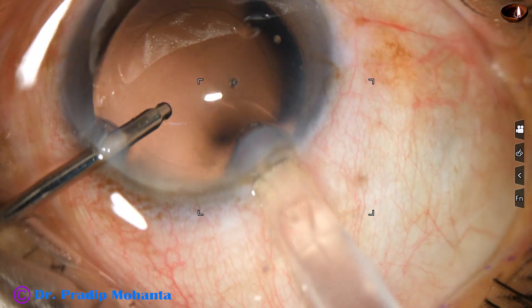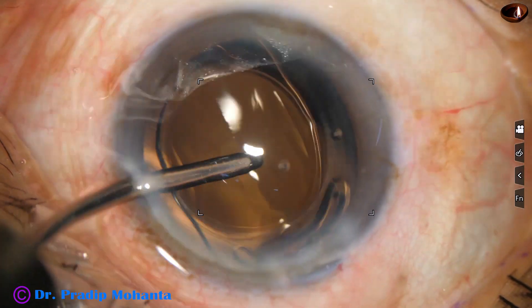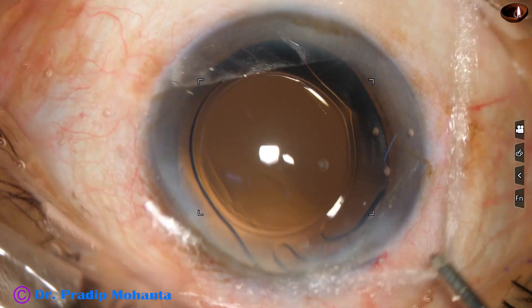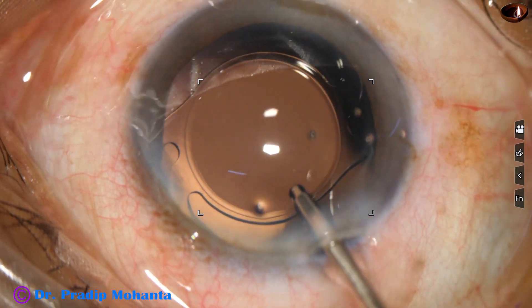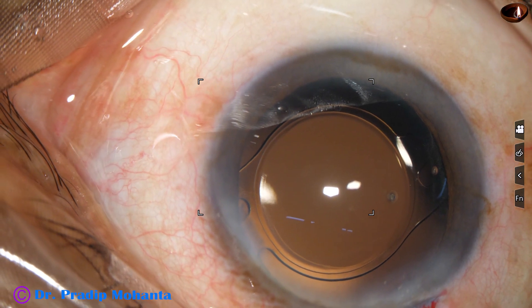And now this is hydroimplantation — implantation of the intraocular lens keeping the anterior chamber maintained by hydro, that is BSS or Ringer's lactate. The lens is in the bag and is dialed by the irrigating probe itself; the Sinski hook is not required most of the time.